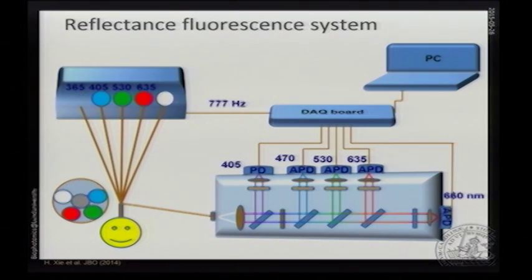So what we have here is this 5-source unit. We have 5 different wavelengths that we alternate. One at a time will shine light to this fiber optical probe that we get in contact with the tissue. We collect light in the center and take it into this detection unit, where we split off the light by dichroic beam splitters to 5 different detectors at different wavelengths.